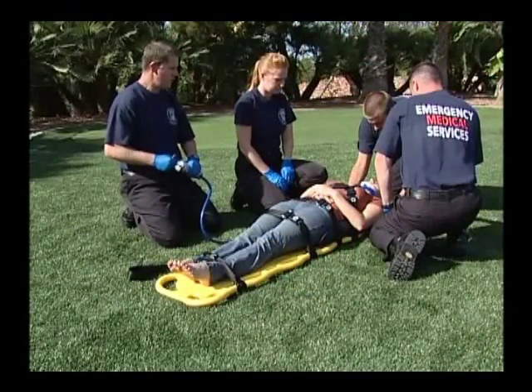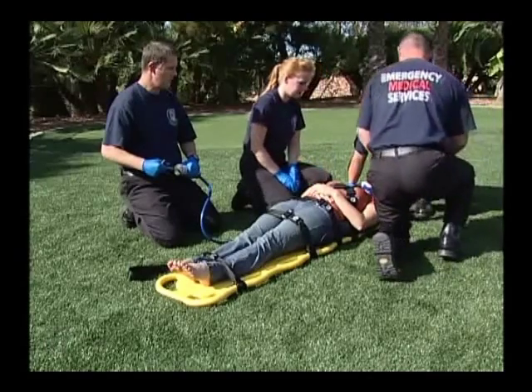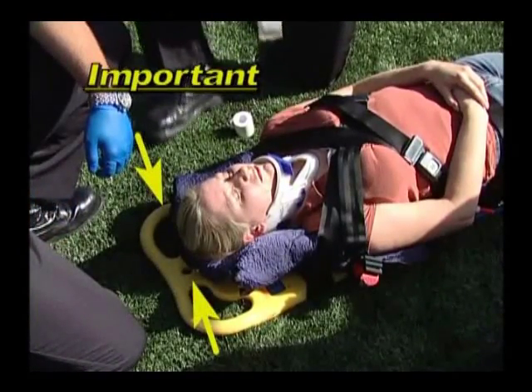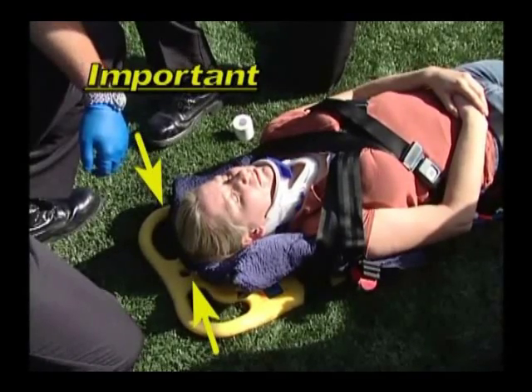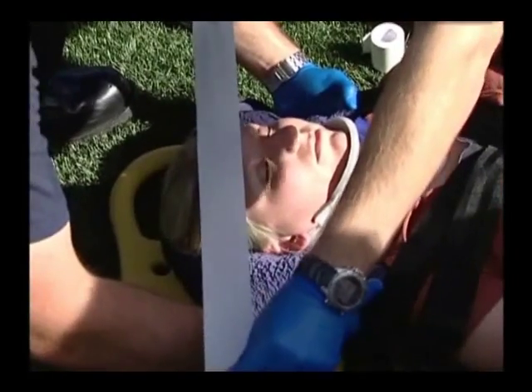Cradle the patient's head with your hands at the base of the head by the shoulders while you evacuate the air from the splint. The evacu-splint should be under the patient's head and should not extend over the top of the patient's head. You can secure the patient with tape if desired.